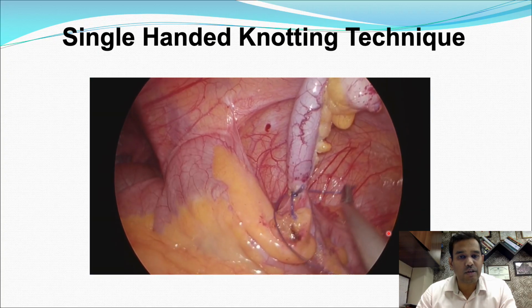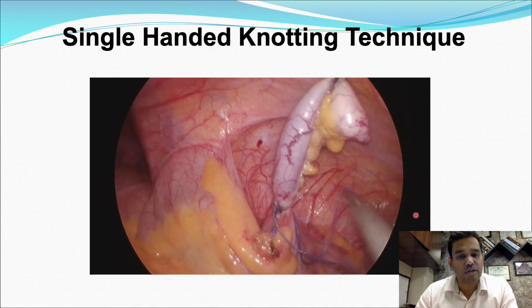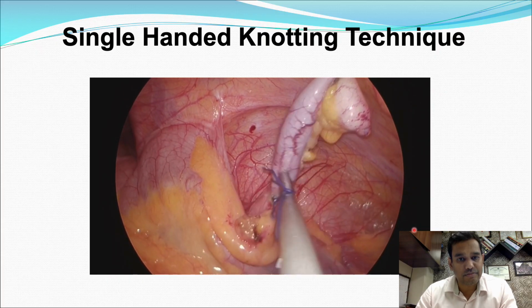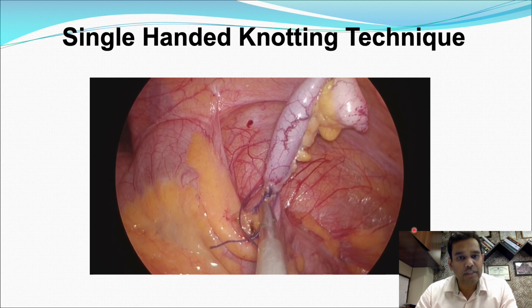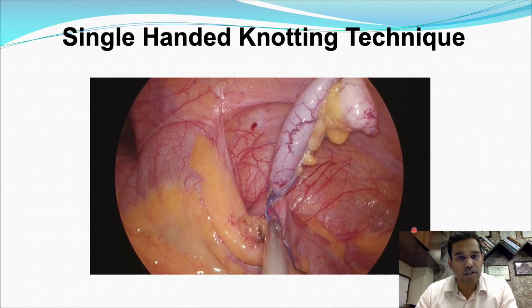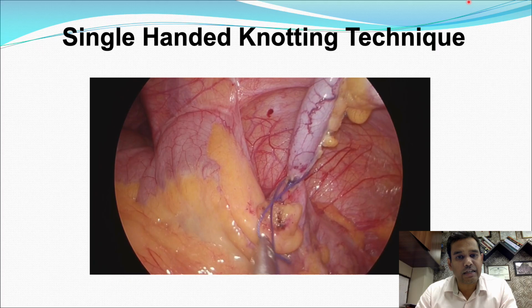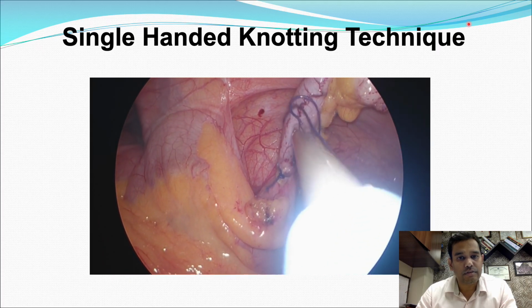You manipulate it with your other hand, and with your right hand you engulf the entire appendix, and then with one hand you manipulate so that you suture the base of the appendix comfortably. This technique becomes very handy when you have only one port, or you are doing it for an appendicular base, or for that sake the cystic artery can also be ligated, and the cystic duct can also be ligated with this technique.